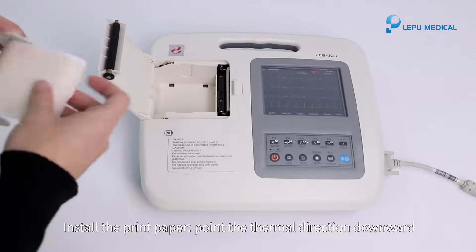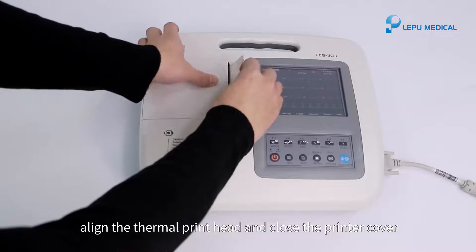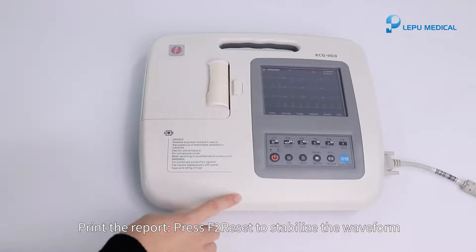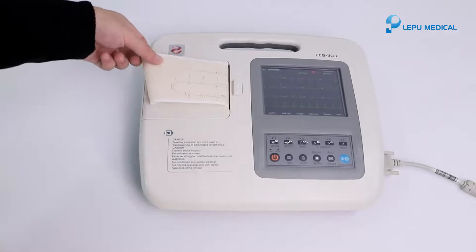To install the print paper: point the thermal side downward, align with the thermal print head, and close the printer cover. To print the report: press F2 reset to stabilize the waveform, then press the print button and the report starts to print.